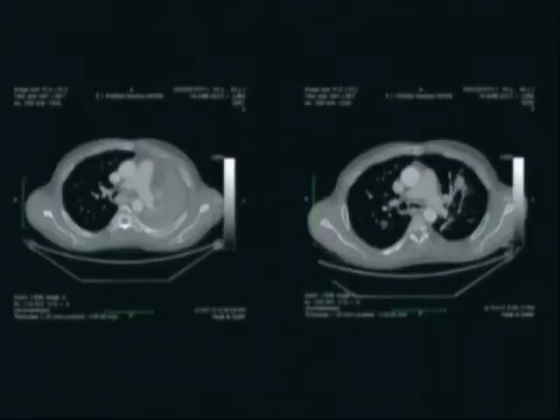This is to show you a case. This is a patient we treated in February, actually, with a total collapse of the left lung with a tumor at the bottom of the trachea covering the carina. This is after 3 hours in the operating room with argon plasma, and you open up the whole airway, and we have a good anatomy.